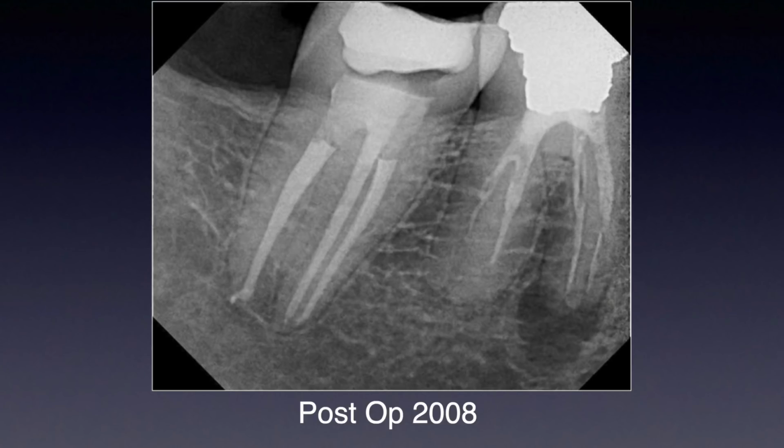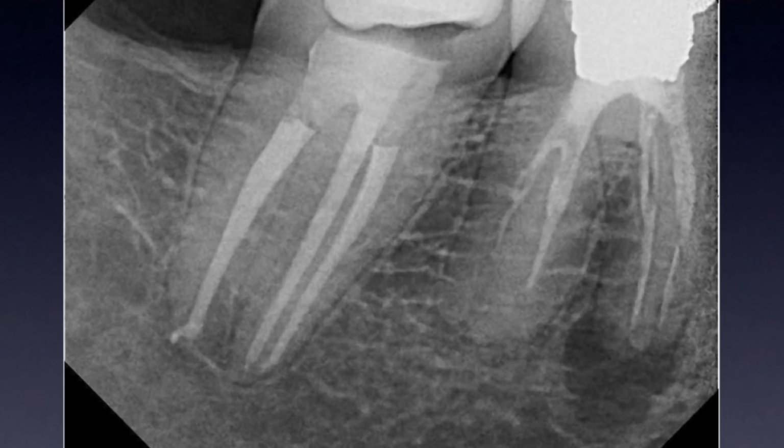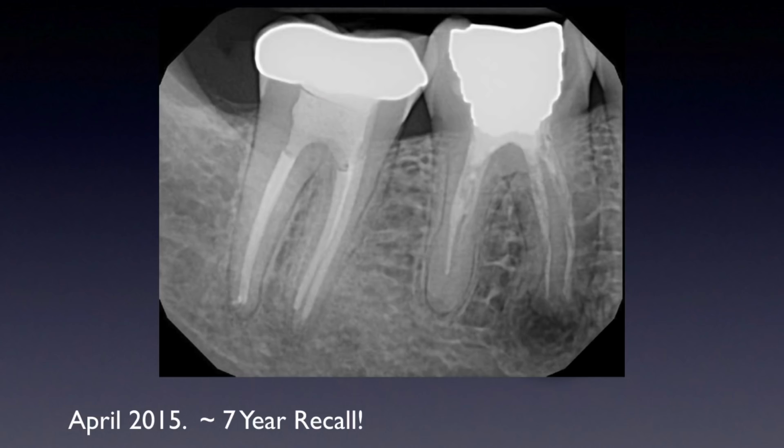He was told to return to treat the first molar, but unfortunately he didn't. So this was in early 2008. Finally, he returned in 2015 since he was having pain on the first molar, and this helped me take a 7-year recall x-ray showing the tooth restored and stable.